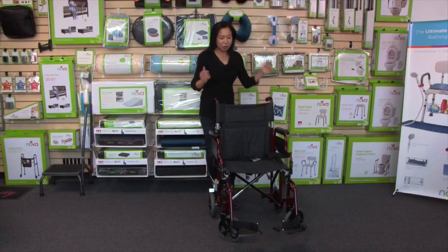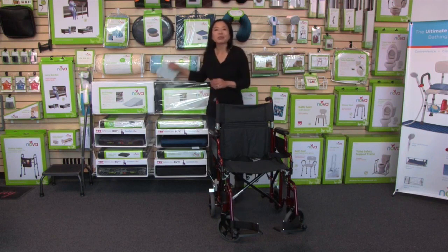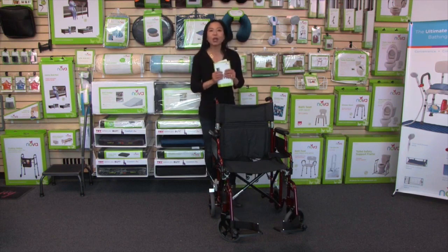That is the lightweight transport chair with flip-up desk arms and anti-tippers. With all NOVA products, it comes with care, use, and warranty information — and most importantly, how to contact us anytime.